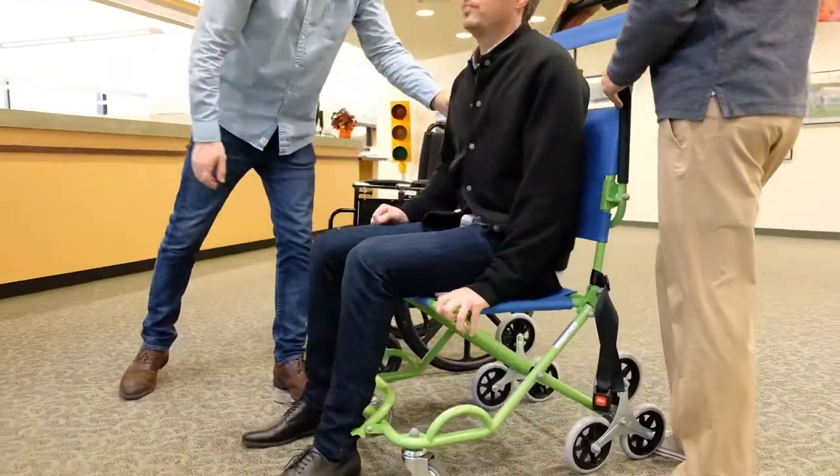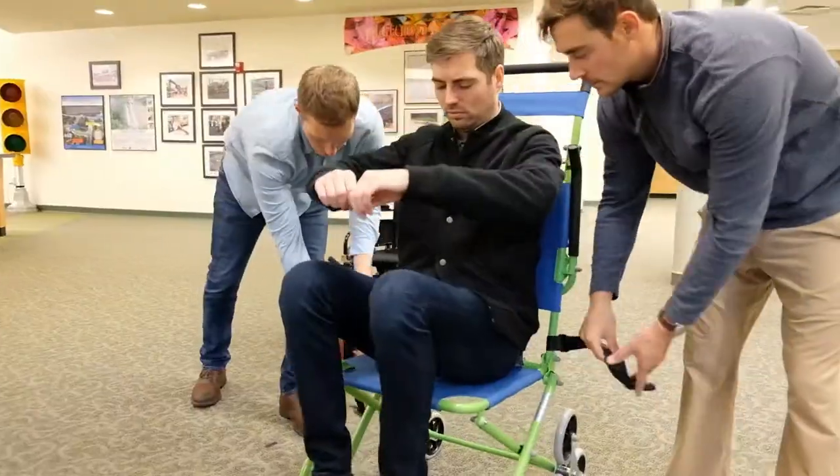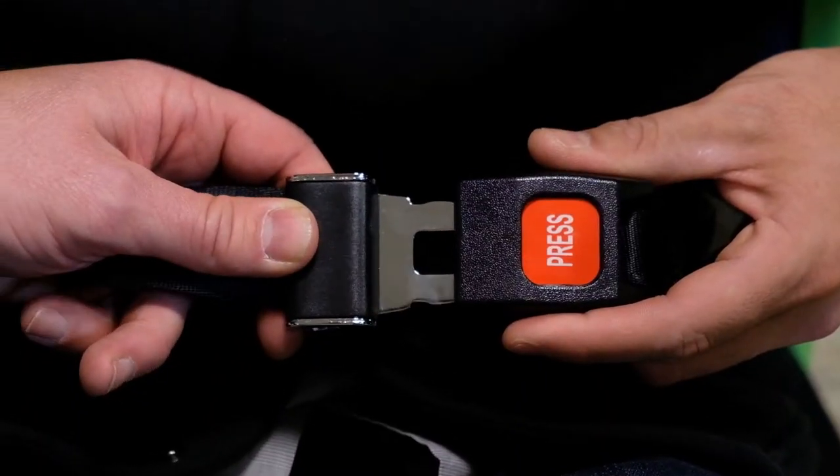Make sure the chair is supported while you do so. Fold out the footrest if required. Fasten the safety belt and pull down the armrests.